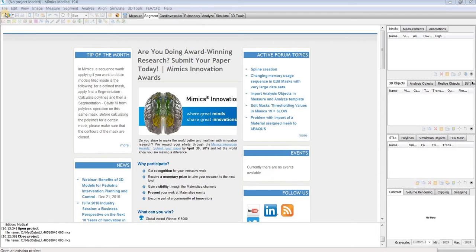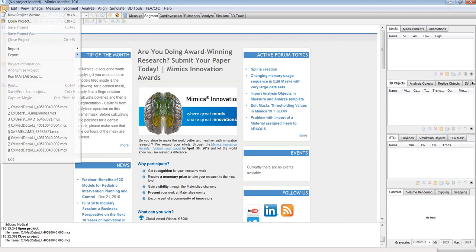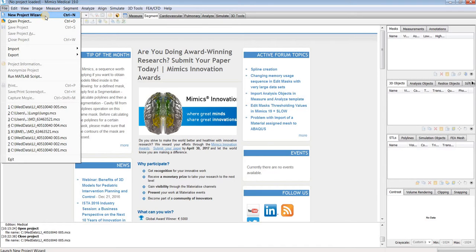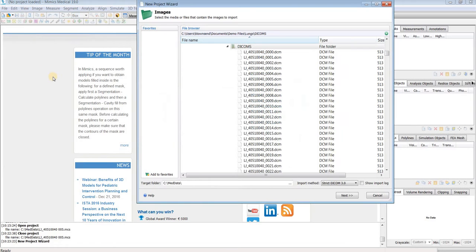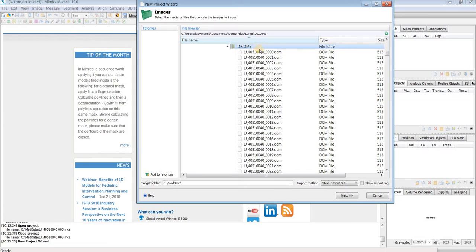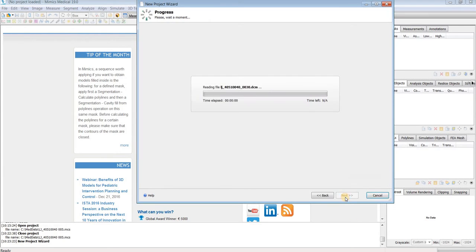The first thing I'll do is go to the file menu and go to new project wizard to import my raw DICOM images. This will bring up this dialog box where I can select the parent DICOM folder that contains all of my images, and then I'm going to hit next.